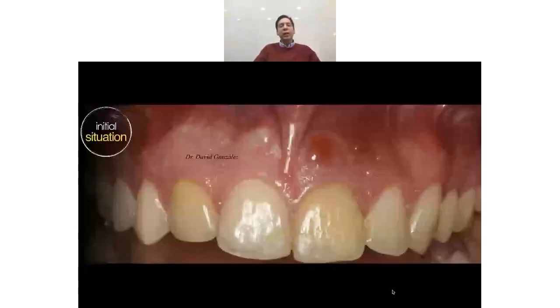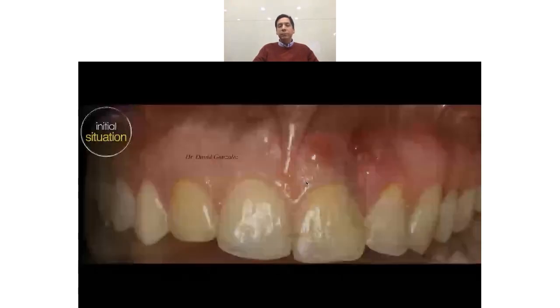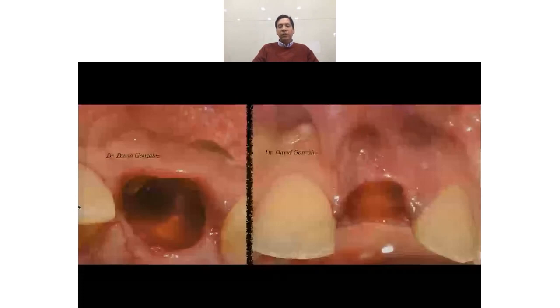Now we will see another case. This is a very, very interesting case. This is a 23-year-old man, non-smoker, and he had a big trauma on the left central incisor. We can see the fistula in here and in here. After extraction, we see the horizontal fracture.